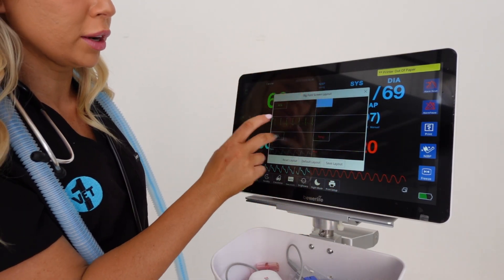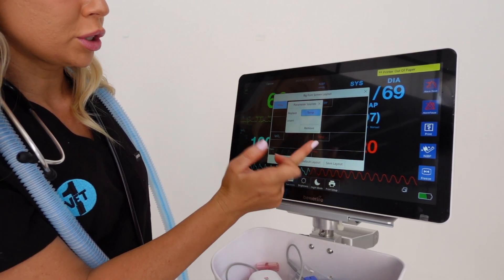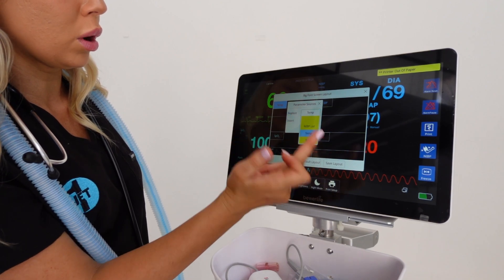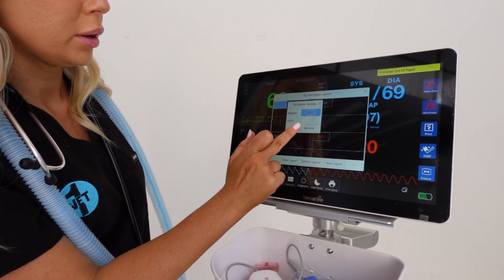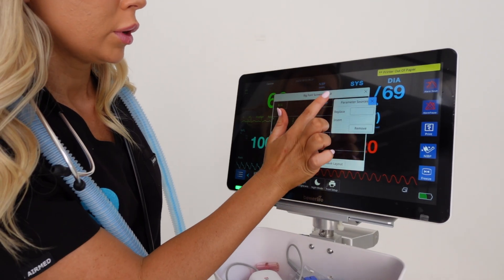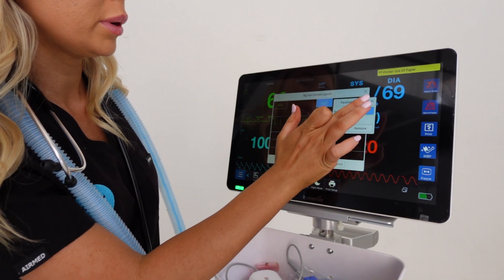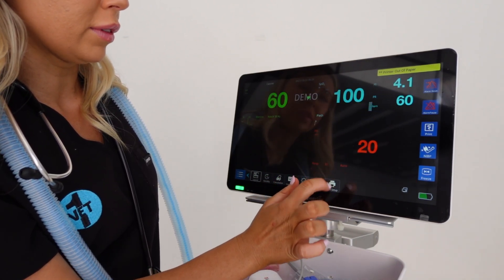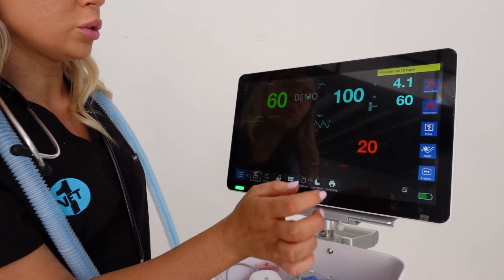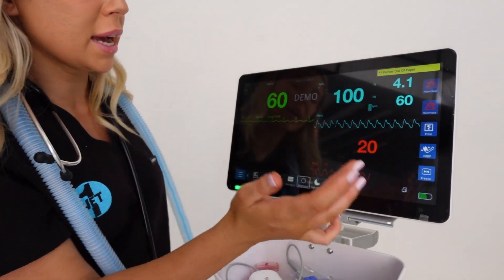If you want to change the layout, you can completely customise it however you want. You press on a parameter - say ECG - and replace it with temperature if you want that at the top. Or I can replace it to put my SpO2 at the top, then save layout. So now I've got SpO2 up here. You can also change the brightness - up or down.